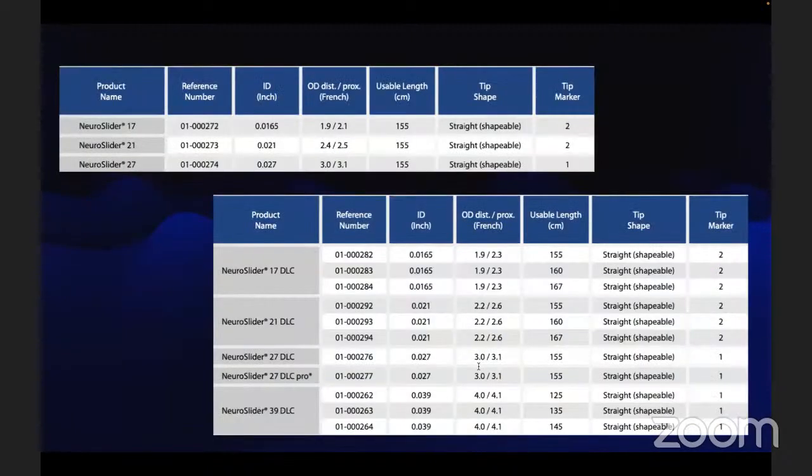And this is regarding the microcatheter. Here 17 and 21 and 27, we used the Neuroslider 27, which will allow the maximum size of the contour, and which has a tip with one marker, clearly visible, where we can detach the contour without any difficulty, sir.